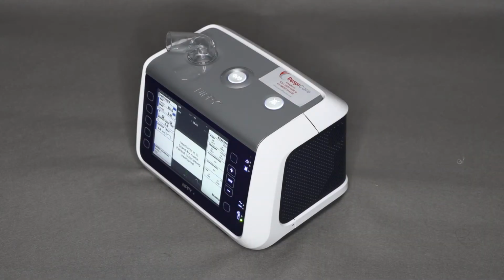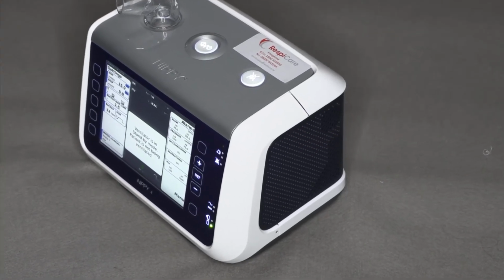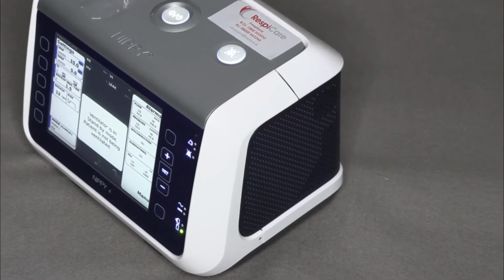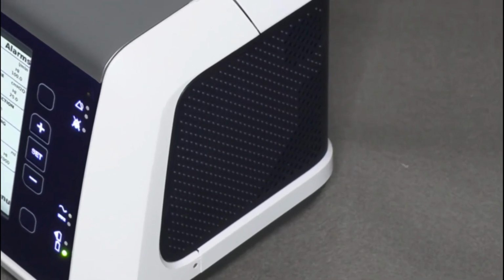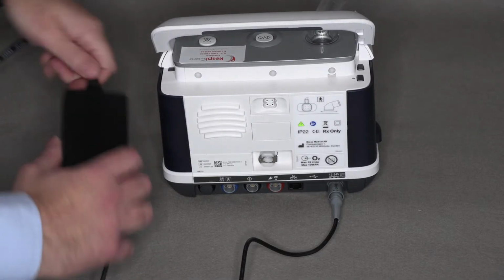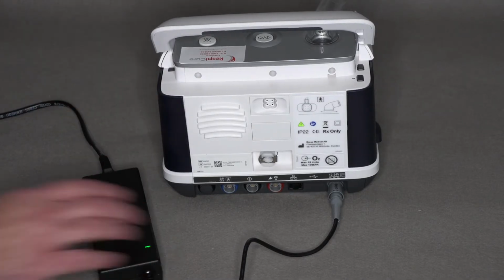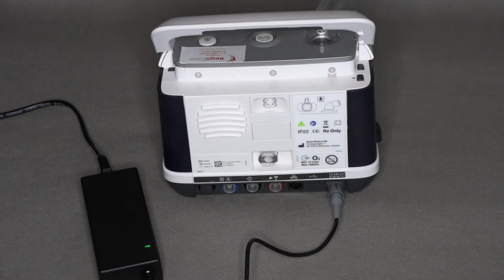To use the ventilator, make sure that the ventilator is on a safe and convenient platform close to the user. A bedside locker close to the bed is usually ideal. Also ensure that nothing is covering or blocking where the air is drawn into the therapy device. You'll need to make sure that you're connected to electrical power, so check that the power plug is in the wall socket and the end of the cable is connected to the power box, and the mains cable is connected correctly into the back of the ventilator.